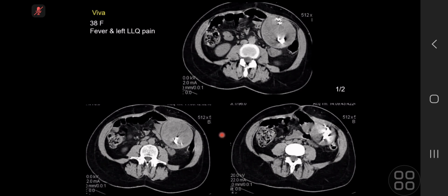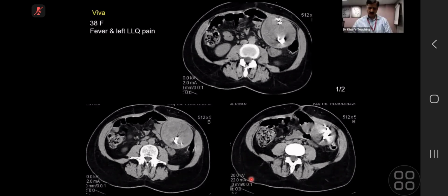this is possibly the metallic bits, it's confusing. I think this is probably a solid tumor with some sort of intervention that has occurred from it. Is there any sort of relevant history? So the patient had some surgery in the past.